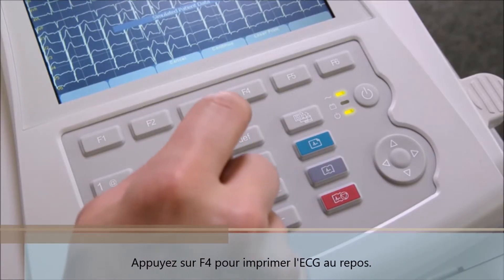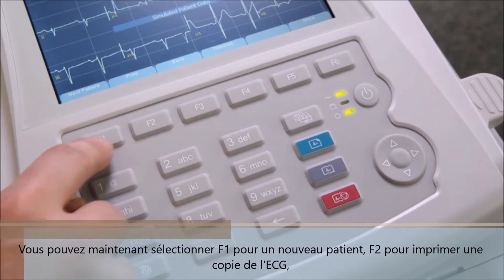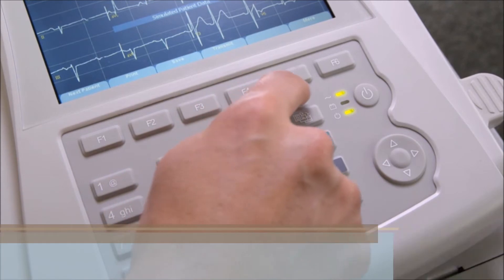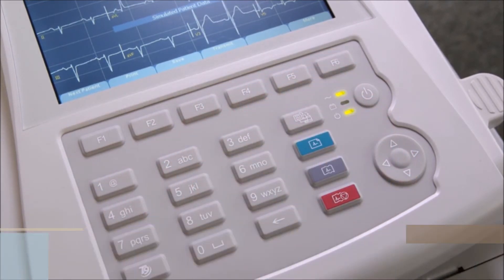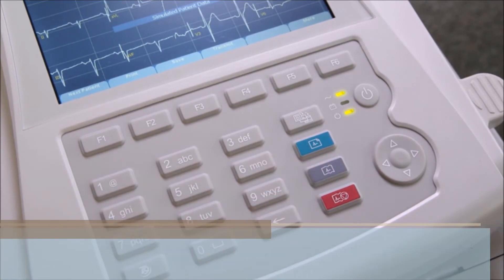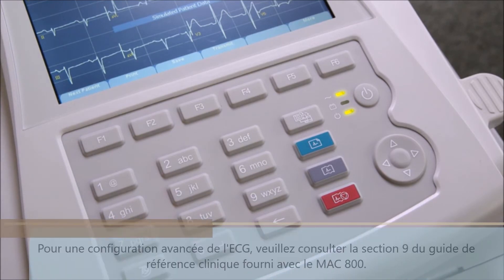Press F4 to print the resting EKG. You can then select F1 for a new patient, F2 to print a copy of the EKG, F3 to store the EKG, F4 to transmit the EKG, and F6 to return to the resting ECG options menu. If a rhythm strip is to be acquired, press the rhythm button on the right side of the keypad below the resting EKG button. The rhythm strip will begin and will stop when the red stop key is pressed.